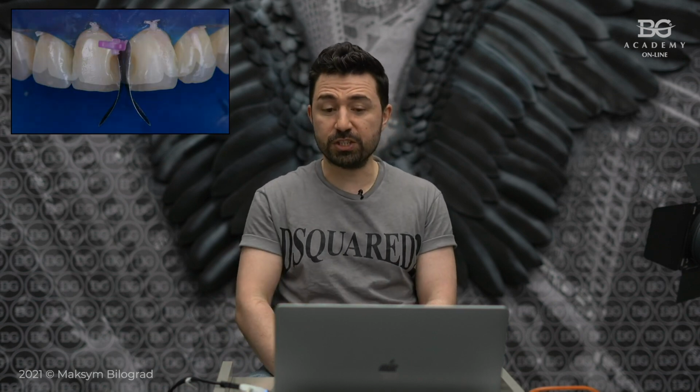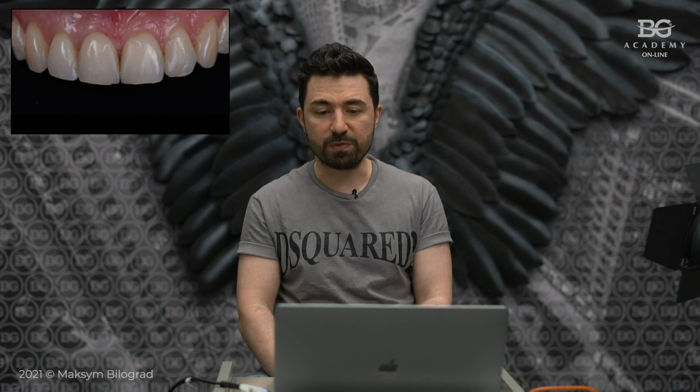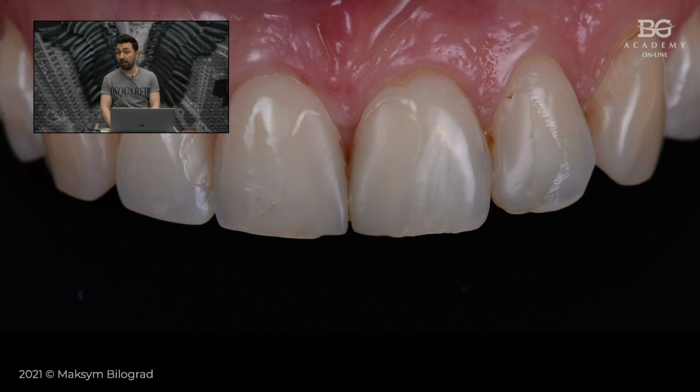Let's go. This is our initial clinical situation. The patient has previous composite restorations made a few years ago, and she was not happy with their appearance. She was not happy with discoloration of those restorations.